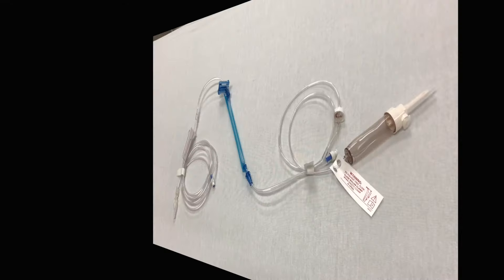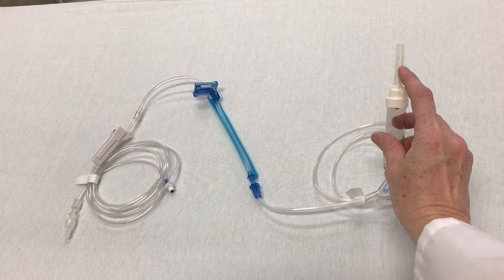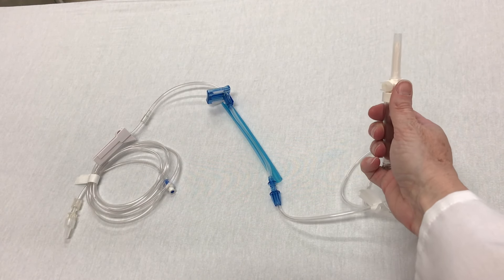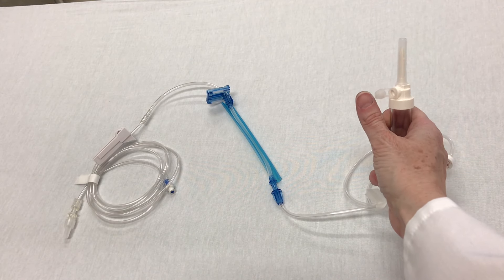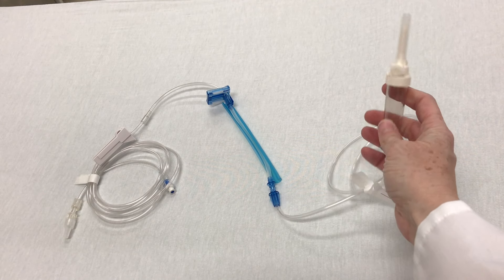We're also going to need an alcohol swab and our label. The IV infusion set is a sterile one-time use latex-free system for providing fluids. At the top we have our spike, and it is covered by a protective sheet that keeps it sterile. The next thing we have is our vent cap. If using a bottle for infusion, we need to open the vent cap to allow air to go into the bottle for fluid to release.